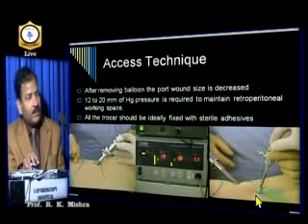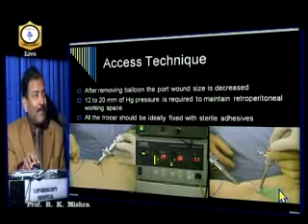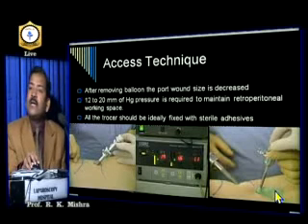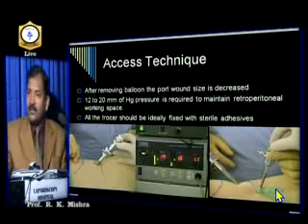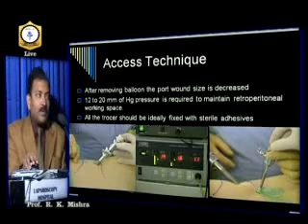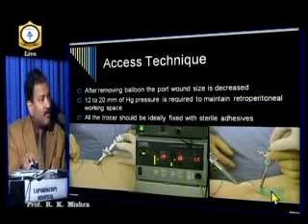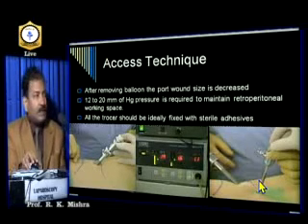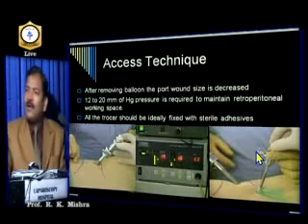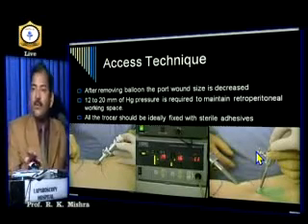This technique can be used in any procedure where the patient is small and thin and you have a repeated problem of the cannula coming in or out. The knot and stitch through the skin prevent the cannula from coming out, and the strapping prevents it from going further in. Even if the strapping does not adhere well due to body hair — in animal models or in any patient — it will still work as a mechanical block. Take a bite on one edge of the same wound skin, tie it at the air inlet, and after that you can work very comfortably.